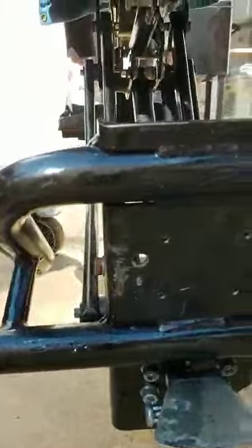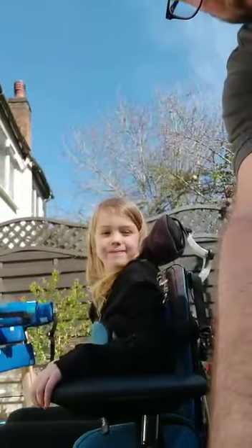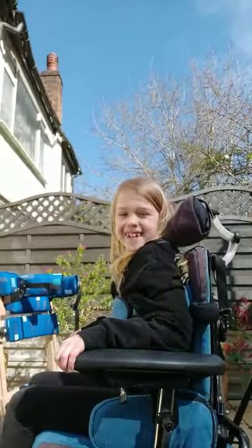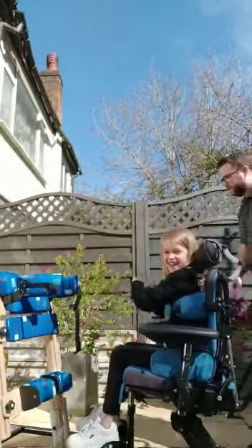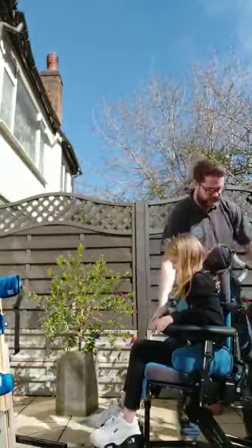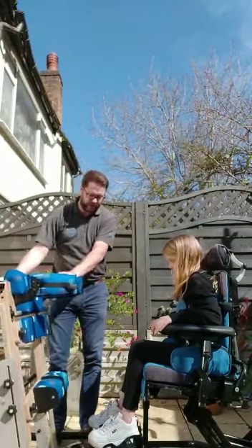On all of our chairs, it has a high-low function — you'll press that down with your foot and then just push down. So I'm just going to do that with Bella now. We're going to bring Bella back here and place the standing frame here also.